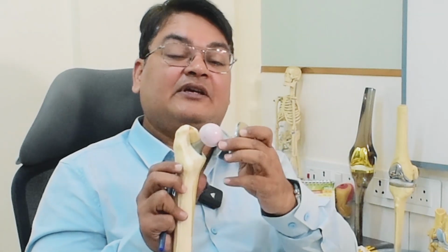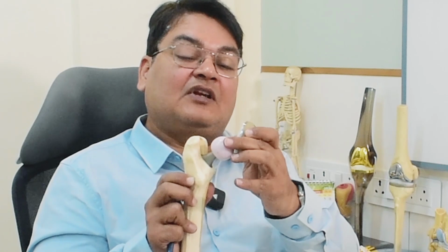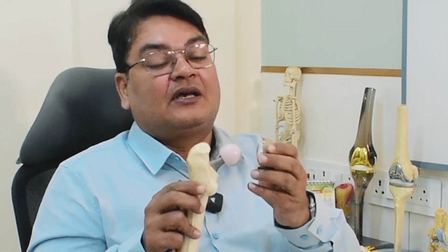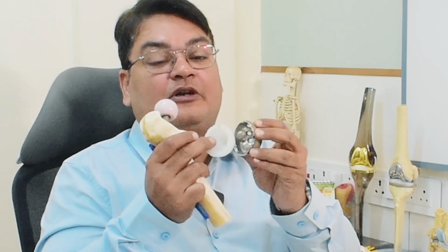And this is the bearing surface. The bearing surface has to be highly polished. It can be cobalt chromium, or it can be ceramic. So we use both cobalt chromium and ceramic. On one side is cobalt chromium or ceramic, and the other side is ultra high molecular weight polyethylene.